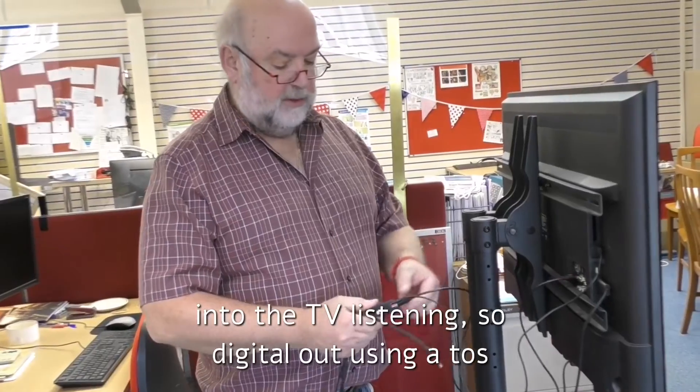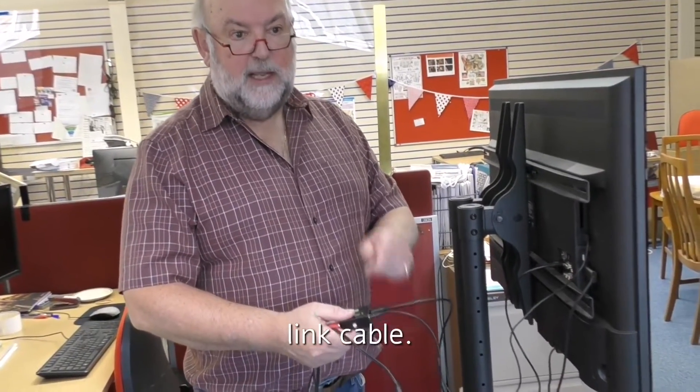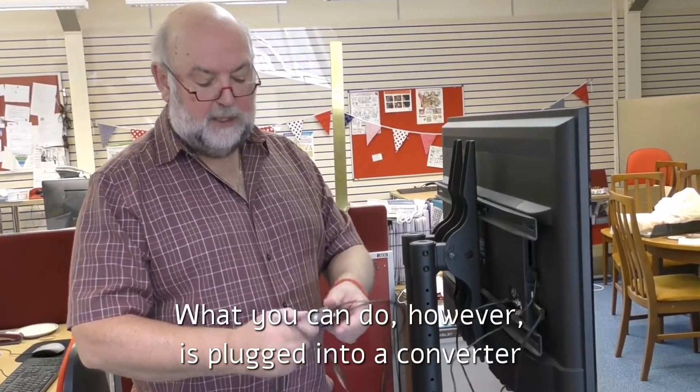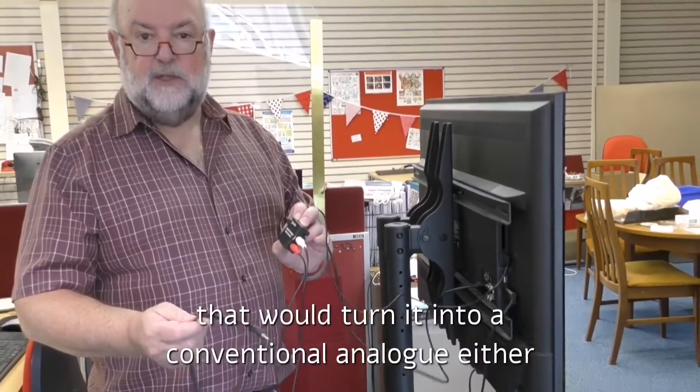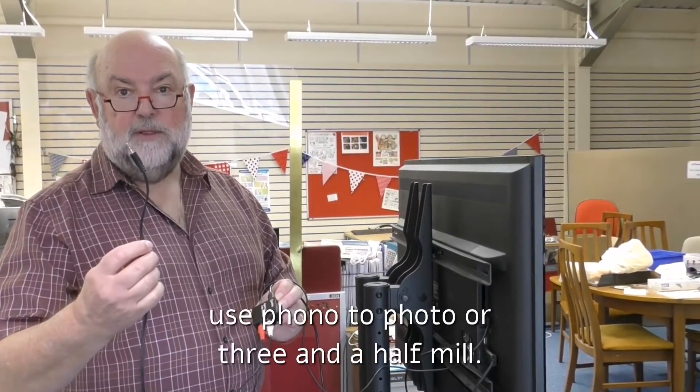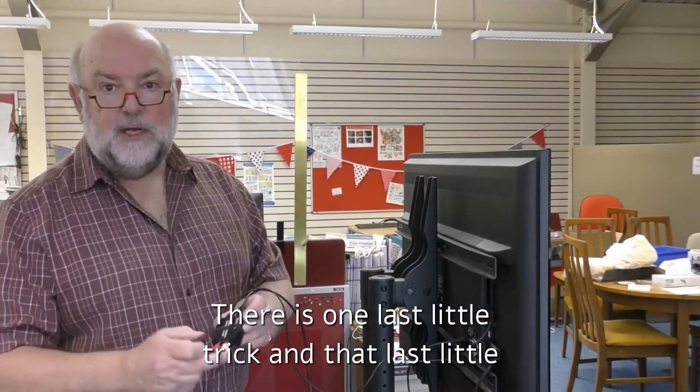So, digital out using a Toslink cable. If you don't have a digital input, that's fine — you can plug into a converter that turns it into a conventional analog signal, and either use phono to phono, or 3.5mm.